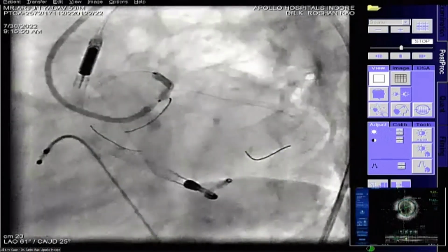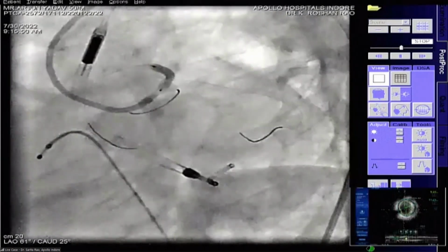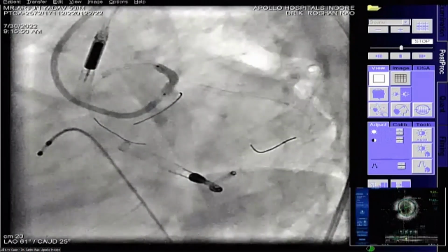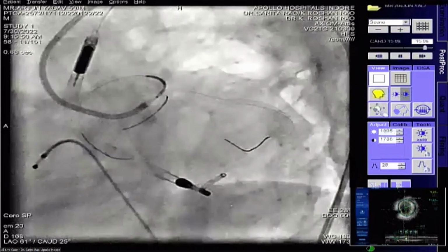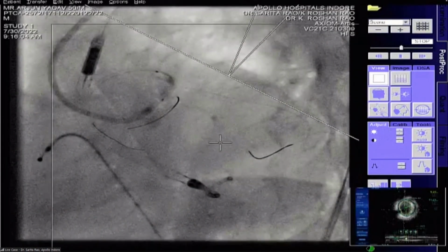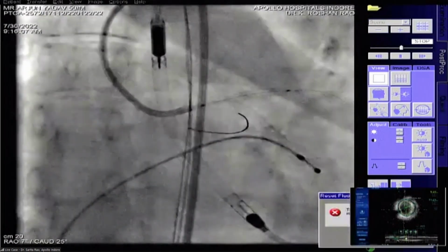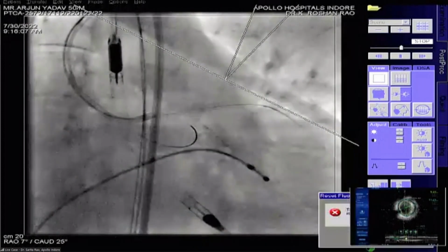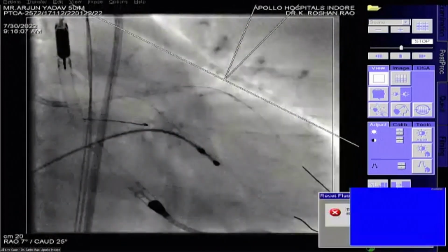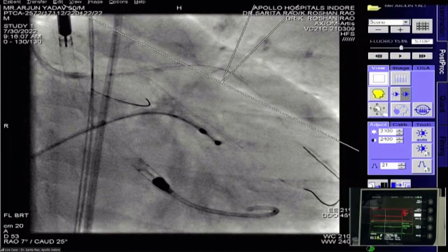As you mentioned, Ramesh, this platform where the stent starts from, the marker is again an advantage in placing the ostium. For the differential expansion, she's preferring the other balloon. Pressure. Okay. Give me a boost. Give me some ephedrine.